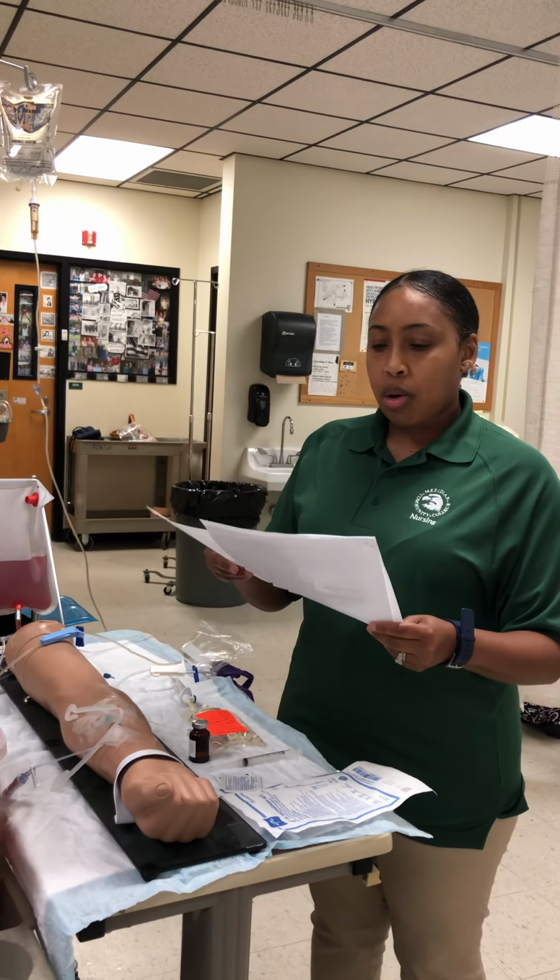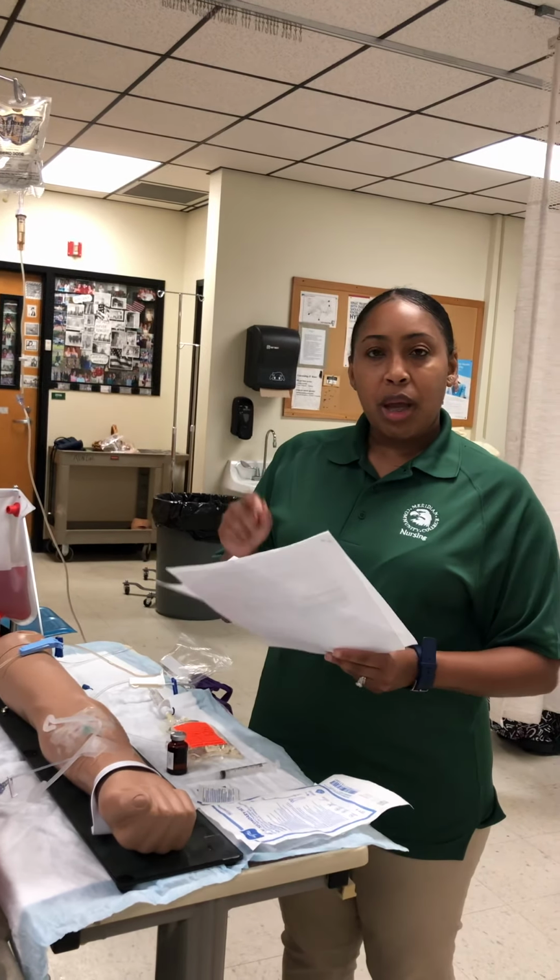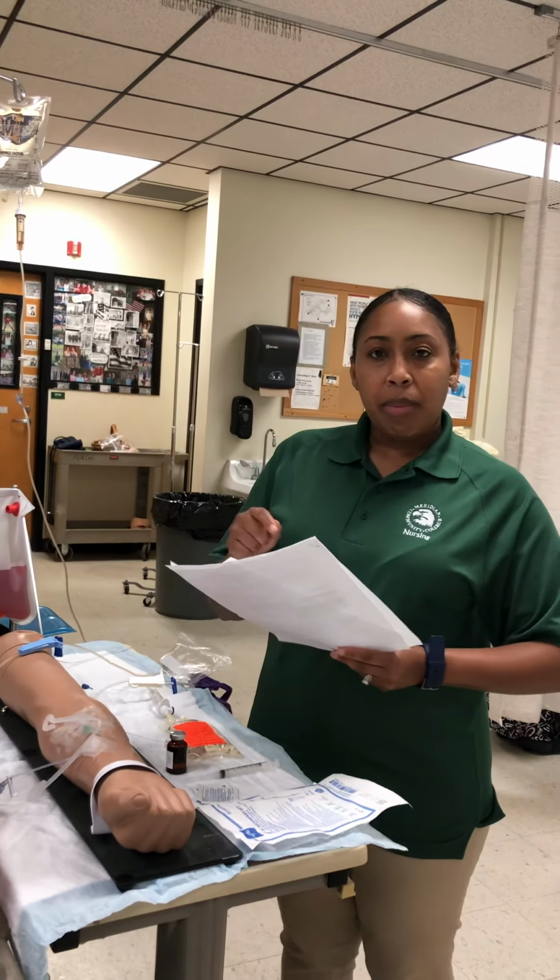So we checked our orders. We're going to make sure that we have the right patient by checking the chart. We're going to check the MAR. We're also going to check the patient's identity when we get in the room. We're going to make sure that we have the right type of medication, and right here I have furosemide, so we know that this is the right medication.